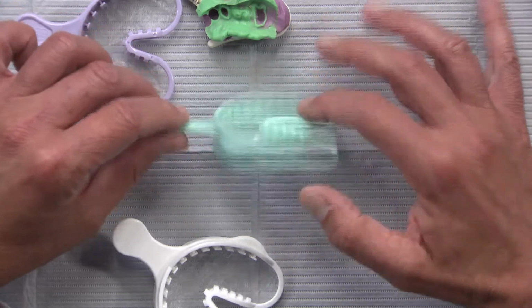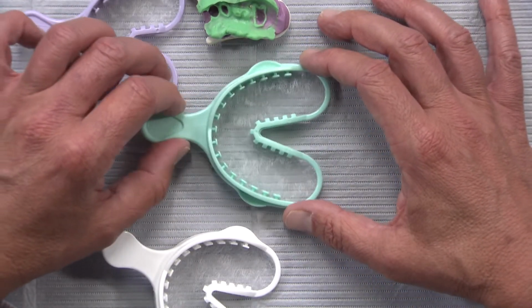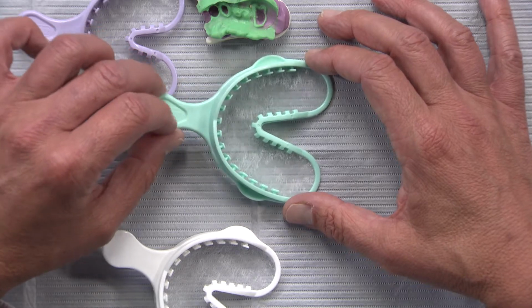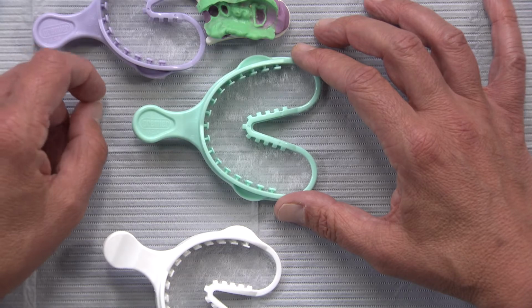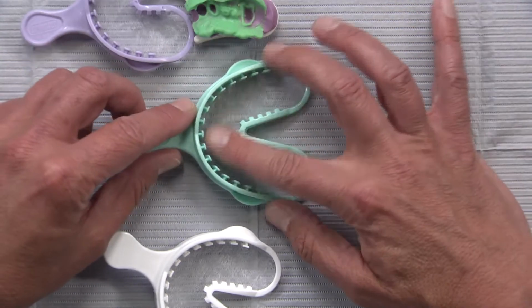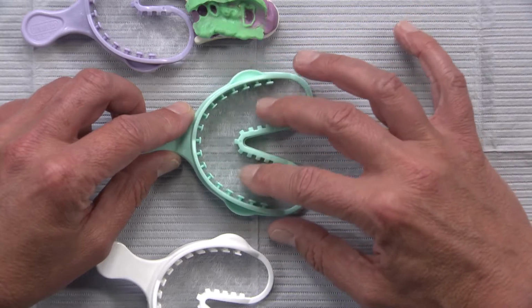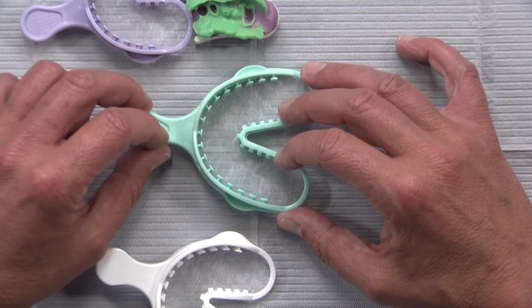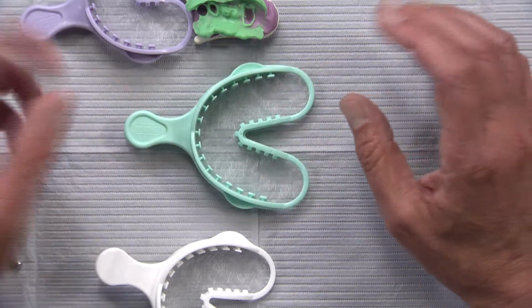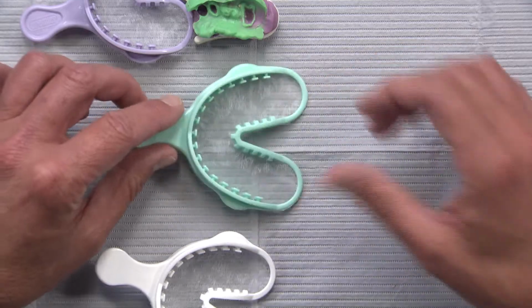So you could use this for occlusal guards, you could use these for snoring devices like the Silent Night, for study models. Anytime you're doing something upper and lower, if I was doing a Silent Night or an occlusal guard, I'm going to use an alginate replacement material in here, because alginate's just not quite accurate enough for me, because we can't get multiple pours. I can go pour it right away here in the laboratory, but dentists will send it from the East Coast wrapped in a wet paper towel.